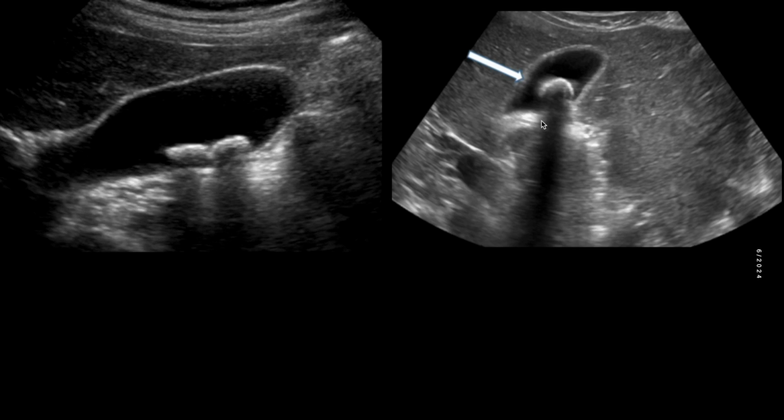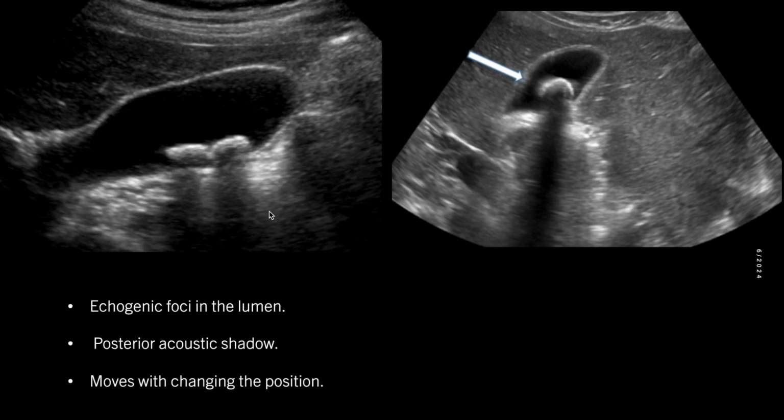Okay. Here is the transverse view of the gallbladder, and again in this view we can see there is a hyperechoic structure inside the gallbladder lumen with posterior acoustic shadow. So this is the posterior acoustic shadow. Normally, if we change the position of the patient, then the gallstone moves from one position to another. So we can see this is the echogenic focus in the lumen with posterior acoustic shadow and it moves with changing position. Remember, it should be hyperechoic, there should be posterior acoustic shadow, and it should be mobile.